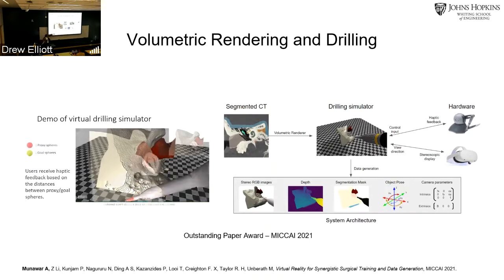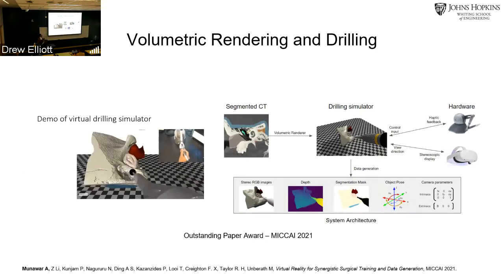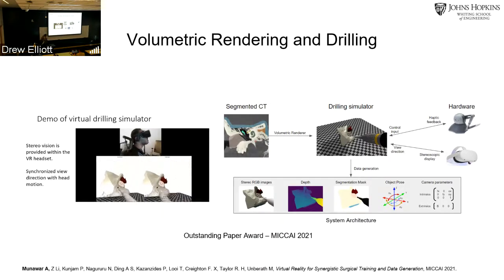The pipeline is shown on the right. Again, no change to the AMBF source code. You load your volumetric plugin through the AMBF description file, and then you can have a plugin for actually removing this bone tissue that's seen here. And you can have another plugin for VR, as you can see here. So it's all very fast, it's all very modular, and it's all very robust.